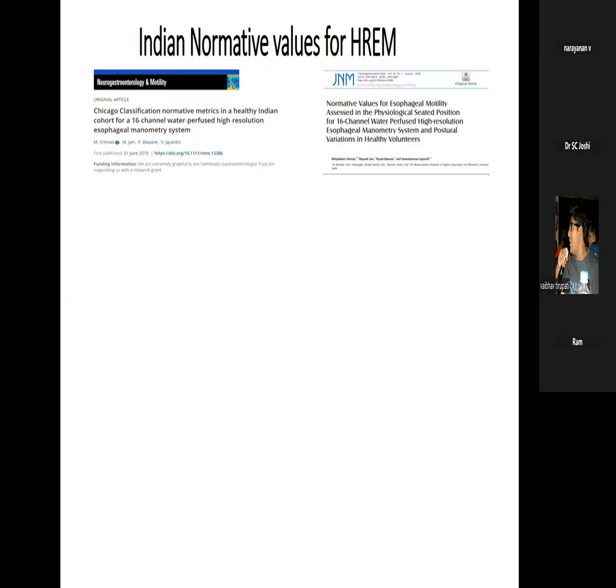All these two studies that you are seeing here were done on 53 healthy volunteers. And I take pride in saying that I was the first volunteer. I put the catheter down myself because if I have to convince my colleagues at work, I have to tell them that I have done it to myself and it was not bad. I sat and put it down in front of the screen, and I operated the computer while my technician gave me the water swallows. I lay down and asked someone to press the button when I did the supine.